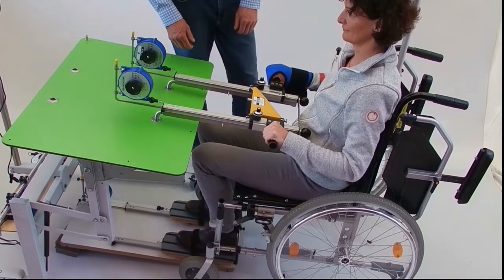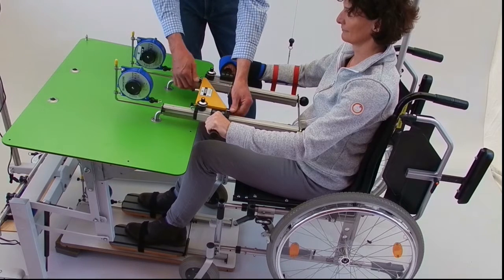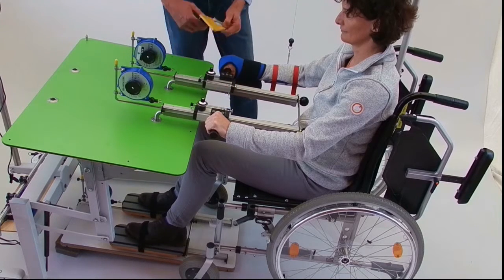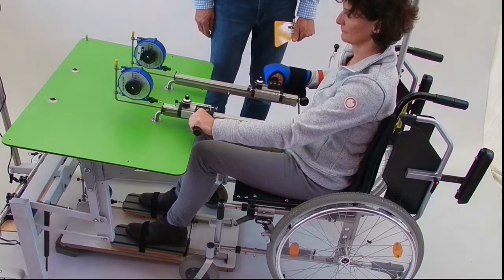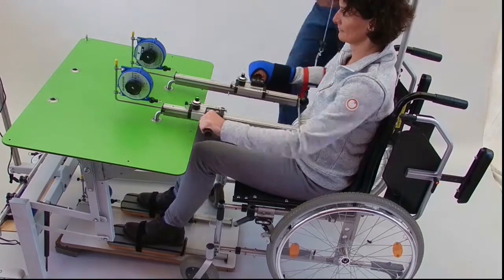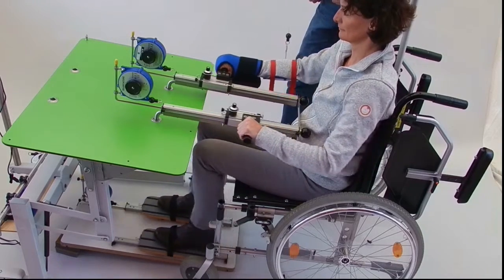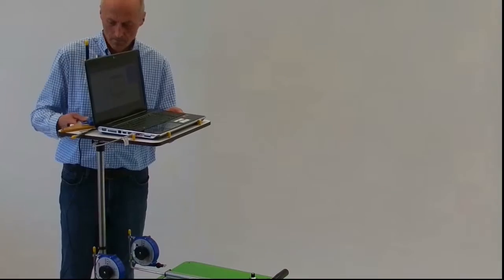During the therapy, the therapist has to decide whether the non-affected side should move the affected one, or whether the affected side should move unassisted. Under the table, there is another exercise device, the leg trainer skater. In that way, the arms and legs can be moved in synchrone or out of synchrone with each other.